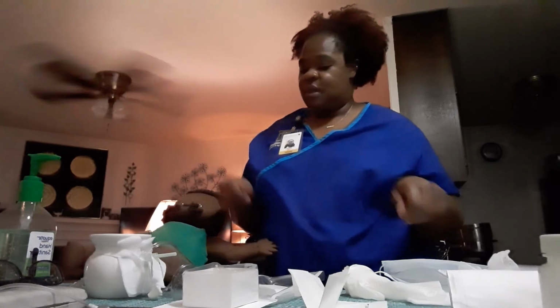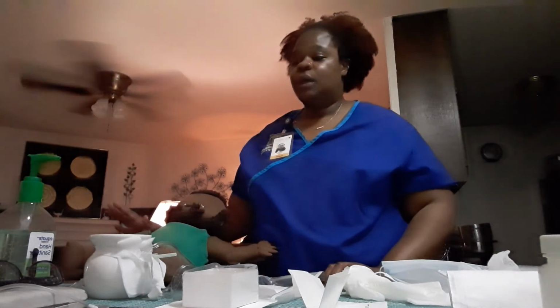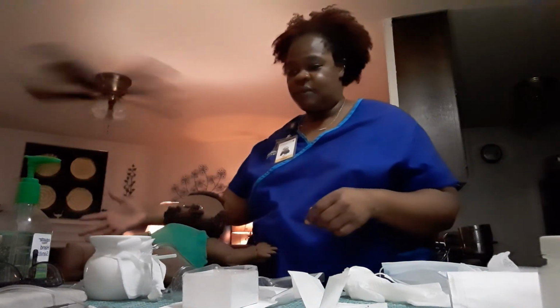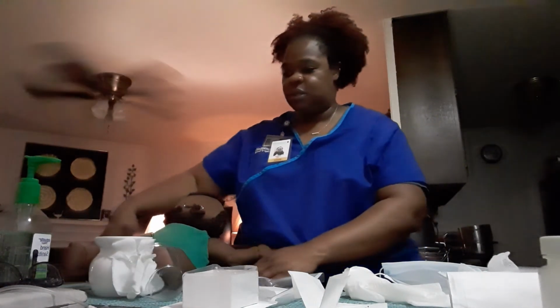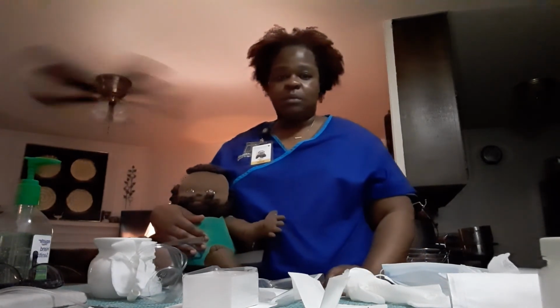Now I would lower the bed, lock the bed, side rails up as needed, give him his call light. I'm going to perform hand hygiene. I will reopen his curtain because we provided privacy during this entire procedure to make sure he had his privacy. And now I would document my findings.